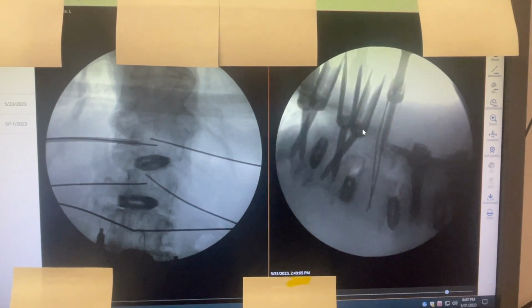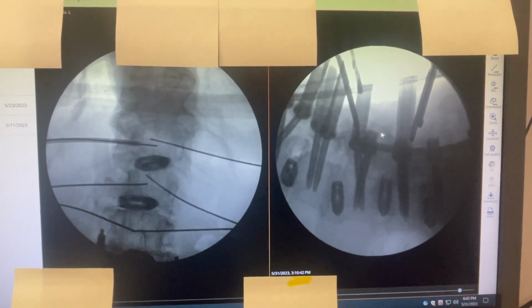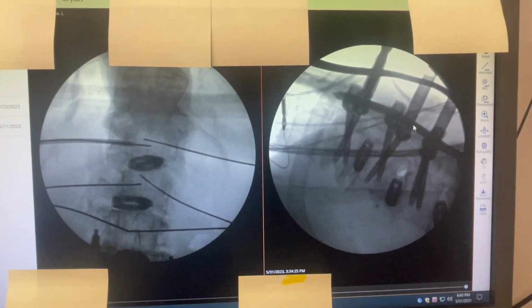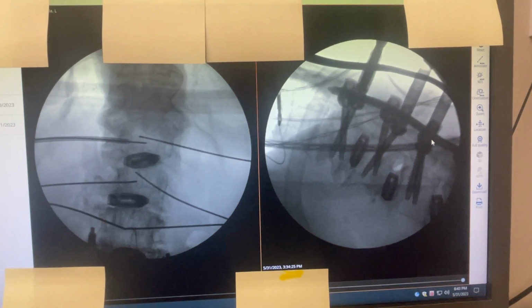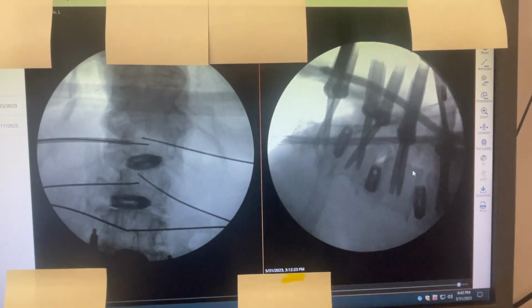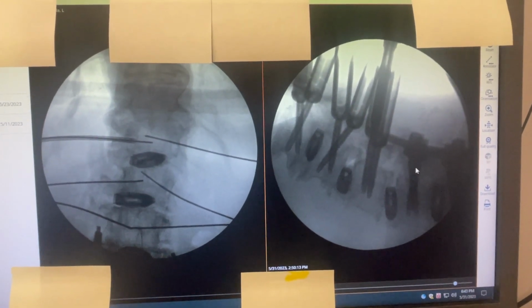Here, since I have a previous surgery done, what I do is a mini Wiltse opening and replace the previous screws in the upper two levels, meaning L3 and L4, and remove L5 and S1 screws, since those levels are fused, and then practically finish the surgery.